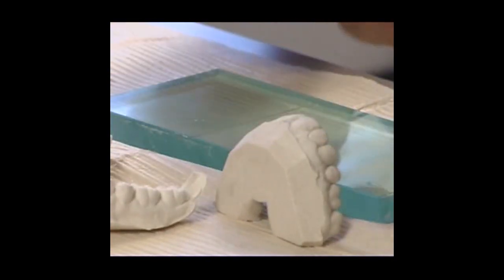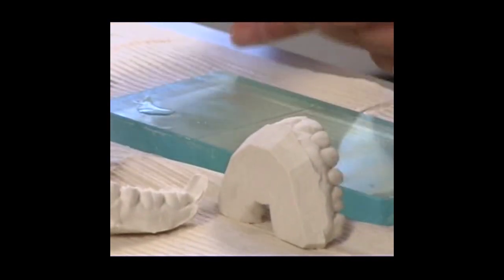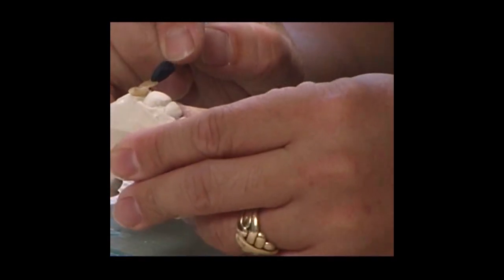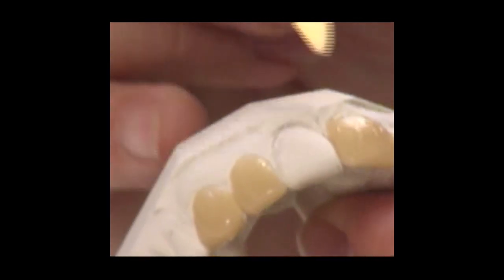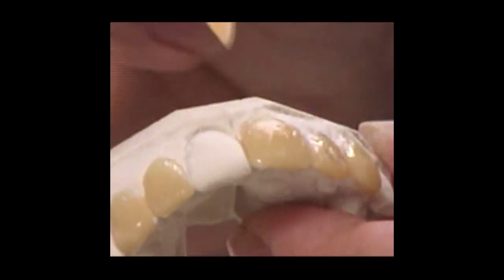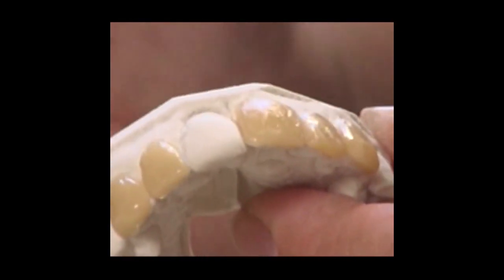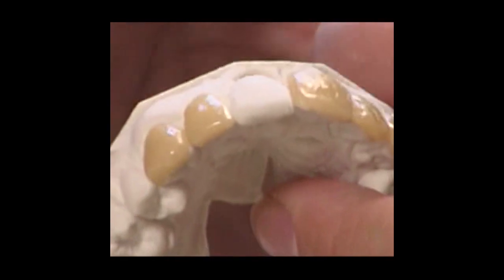This is just the indirect composite. The model and liquid on, so easy to handle. You cut the composites out, starting with the most important area of your central. Place them on. We'll make it a little bit bigger, a little bit longer, a little bit wider, and slightly over the gum also for temporary purposes. This is not just a visual aid to the patient. This is also for making temporary stents. That's why we're using composite, so we can do a stent over it.